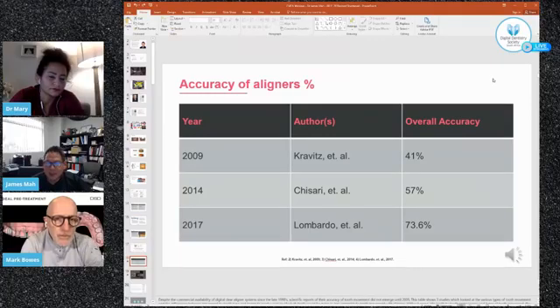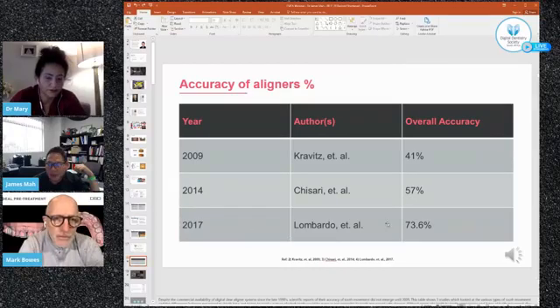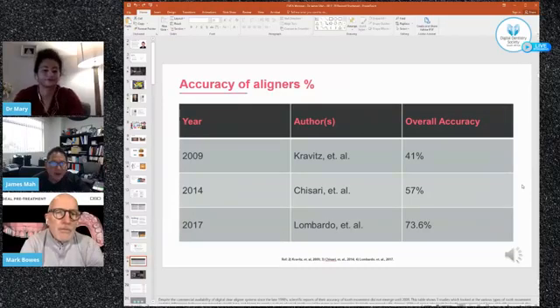So collectively, people in the entire profession learn, and that's why I say everybody's on a learning curve here. If you think about it, 2009, 2014, that's not that long ago, but we're getting so much better here. If we implement the latest concepts of staging in conjunction with better systems, everything's improved, from the scanners to the software to even materials, and I'll touch on that in a minute. I think we're going to continue to improve our overall accuracy, but it means continued learning for everybody and being a continued student on this topic.